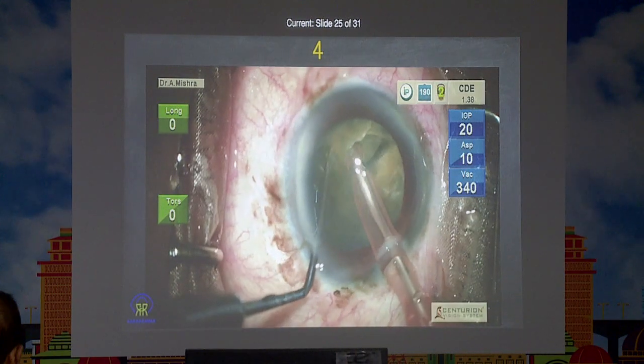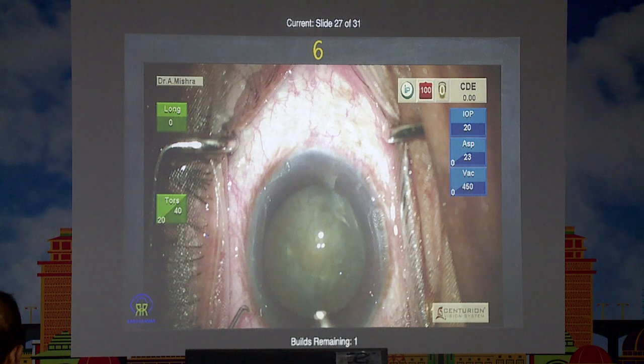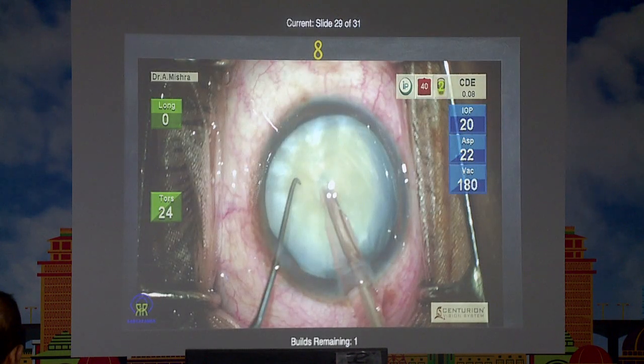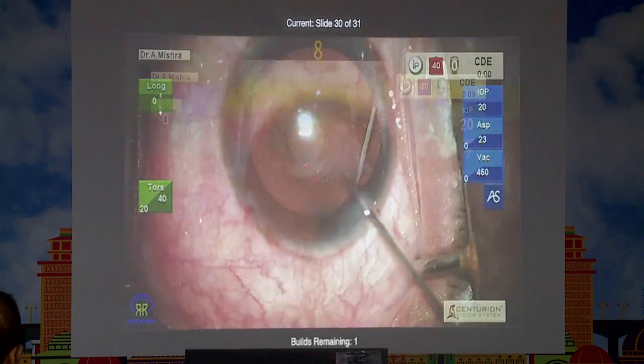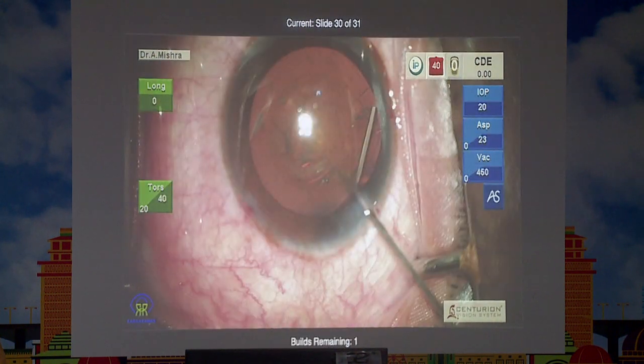We are in the fourth case in the same series, and this is perilously close to, you can look at the volume of fluid now in the bag is reduced down to 40, and still the last case was done with 40 milliliters of fluid. This will be further exemplified in the next case. This was the last case. This is how the machine is challenged to the extreme.